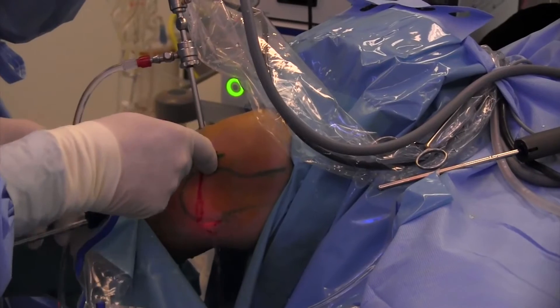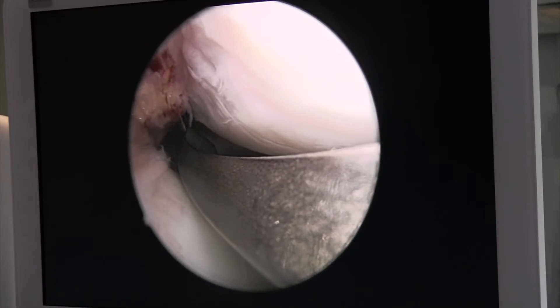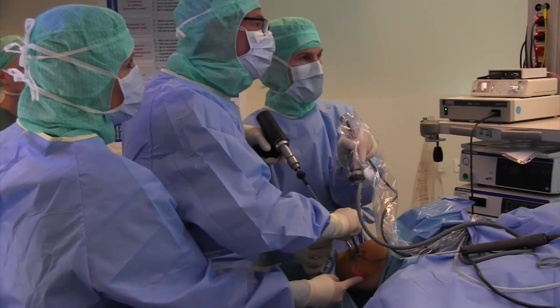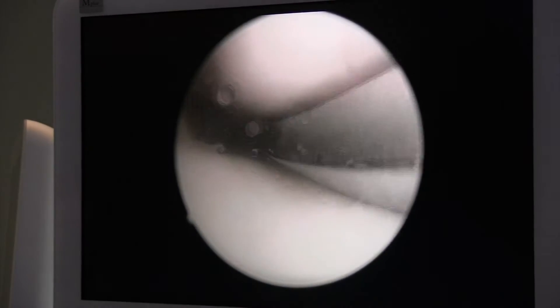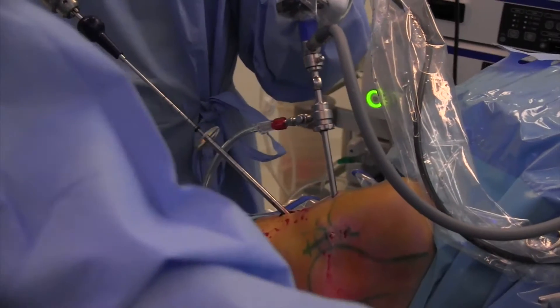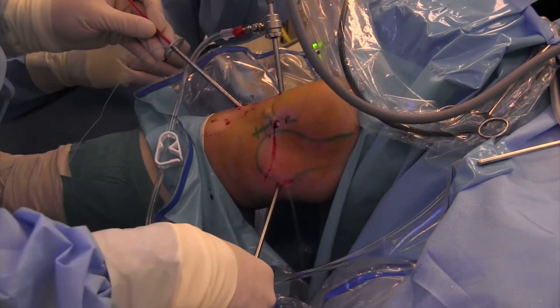This is the aiming device to get the socket into the correct position, intra-articularly. And with a flip cutter, I know how deep the socket is made — one centimeter, one and a half centimeters.